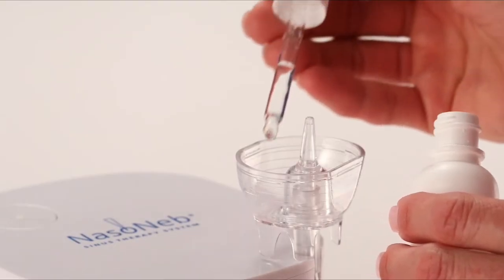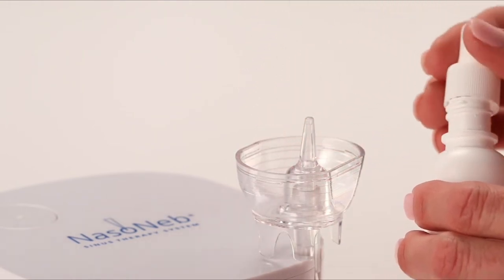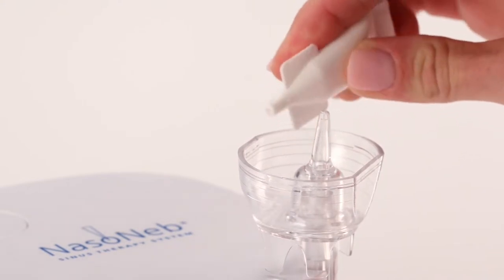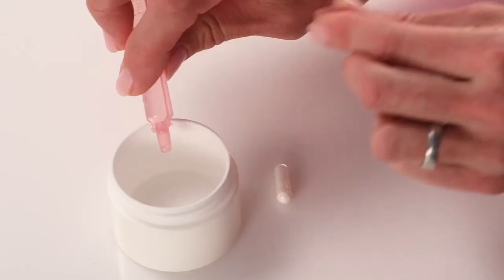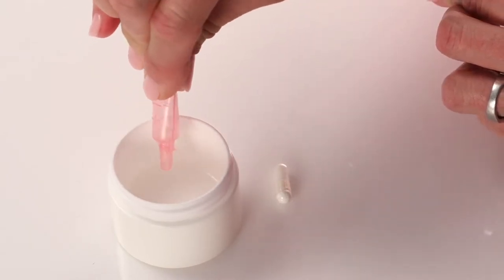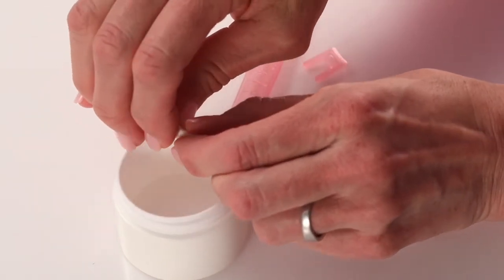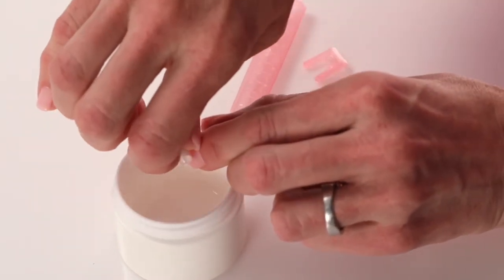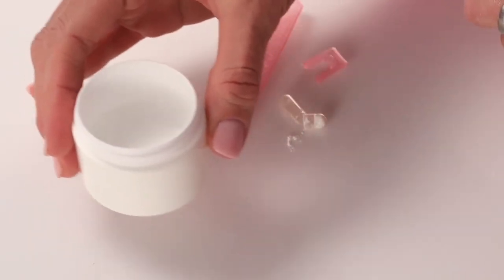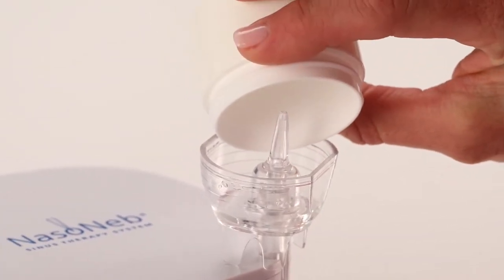Place the moisturizing nasal solution for Nasoneb into the cup. If you have been provided with liquid medication, simply remove the tip. If you have been provided with powder medication and saline, empty one dose of saline into the mixing container provided by your pharmacist or a clean measuring cup. Pull open the capsule and empty the contents into the saline. Swirl the mixture until it is uniform. In either case, empty half of the medication into the Nasoneb cup.